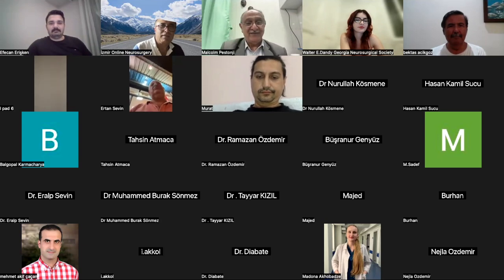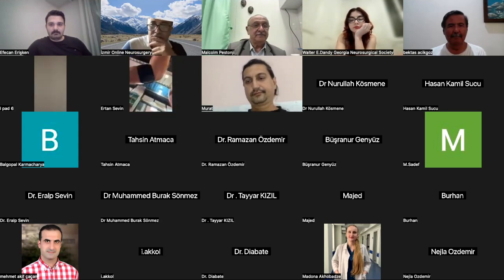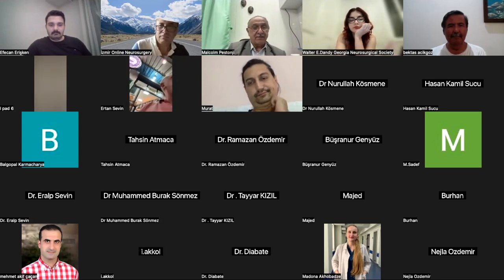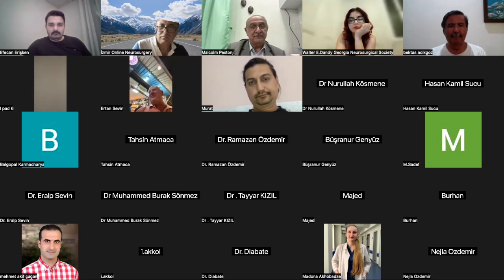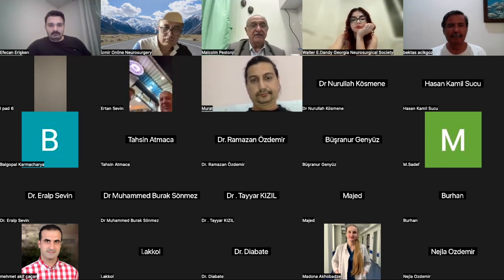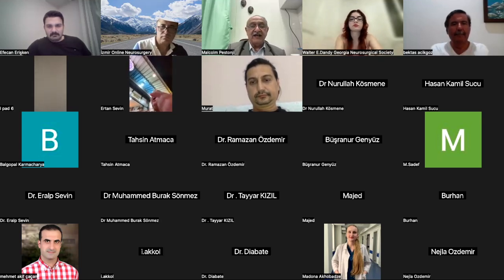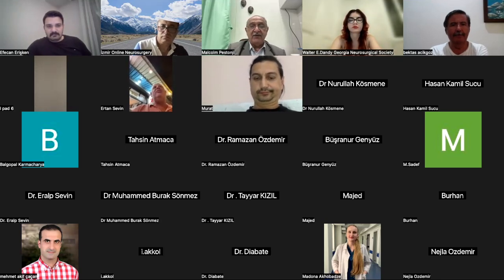But now, before we wind up, let me share my screen once again. What you can see here is the playing of the video. You can see the flaval separation zone developing here. Can you see the flavum separating from the lamina? That is the cranial end I have reached. This is my facet on my side. Now I'm doing a flavectomy on my side.